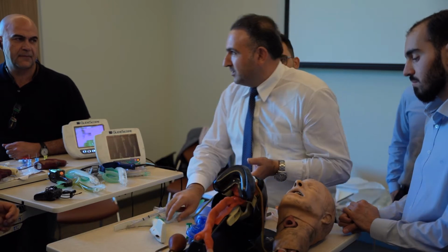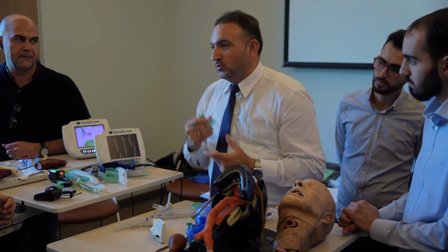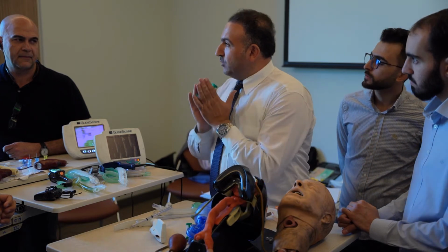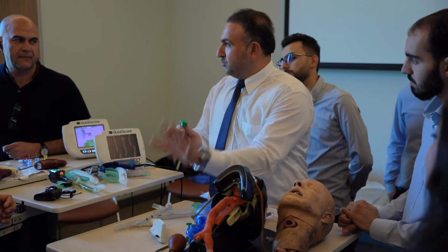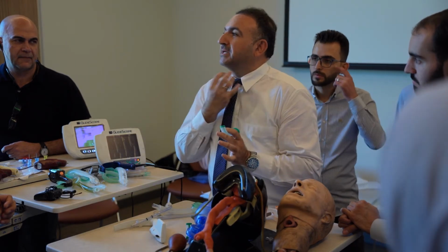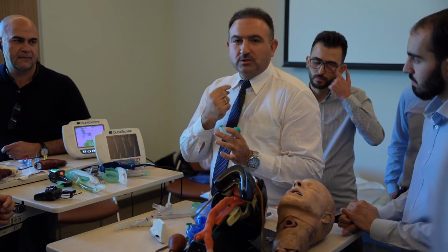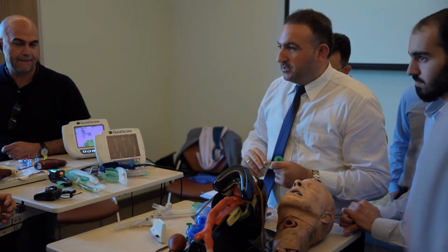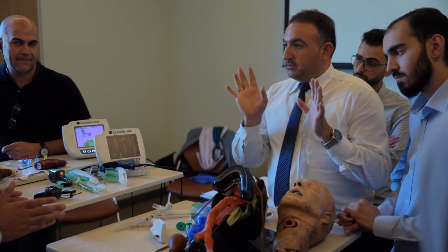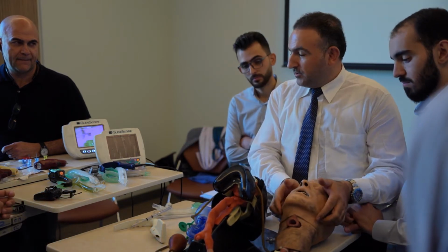So if I don't have the proper size airway, don't go with the wrong size, neither the larger nor the smaller. If it's smaller, we will push the base of the tongue and we close the airway. If it's larger, we will close the airway by causing injury to the vocal cord and epiglottis. So if it wasn't available, we will step back to bag valve mask ventilation. Exactly. Ambu bag and jaw thrust. Okay?